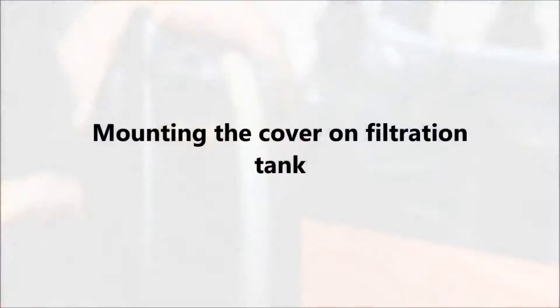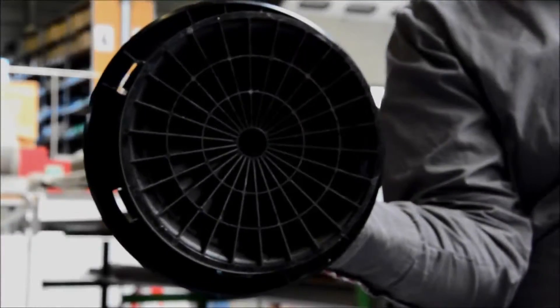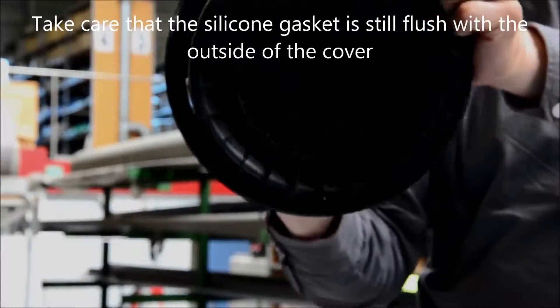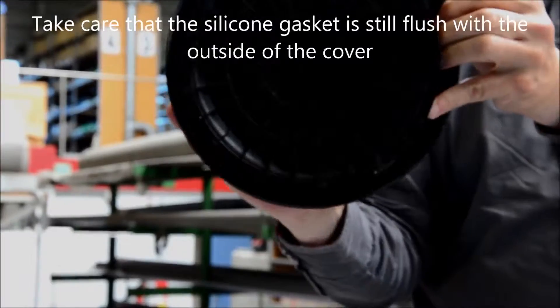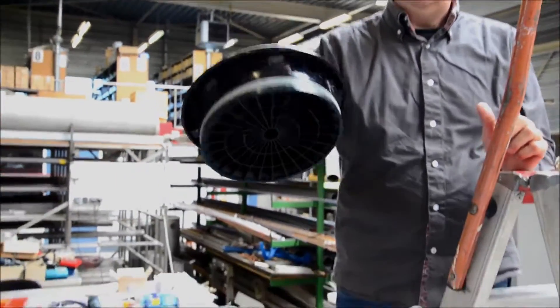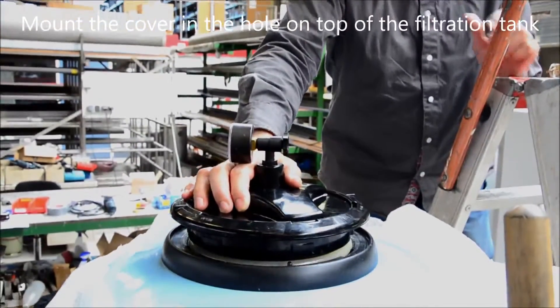Mounting the cover on the filtration tank. Take care that the silicone gasket is still flush with the outside of the cover. Now mount the cover in the hole on top of the filtration tank.